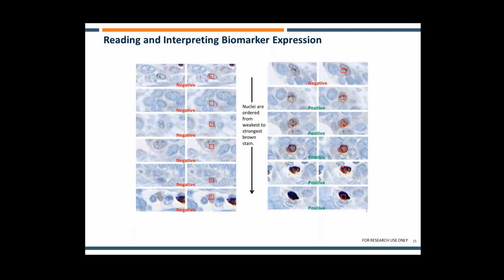And of course, I have the luxury of visiting a lot of pathology labs, research places, and industries, and it's very, very rare that I have two pathologists or even two people setting the exact same cutoff. So some would believe that the top image to the right should also be positive. Others would believe that the positive boundary should be a bit lower in that setting. So it's very, very difficult to standardize the reading and interpretation of these biomarker expressions.